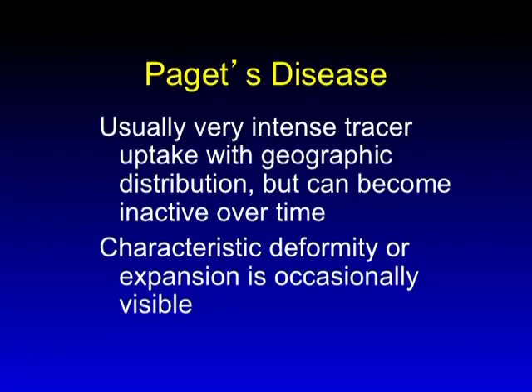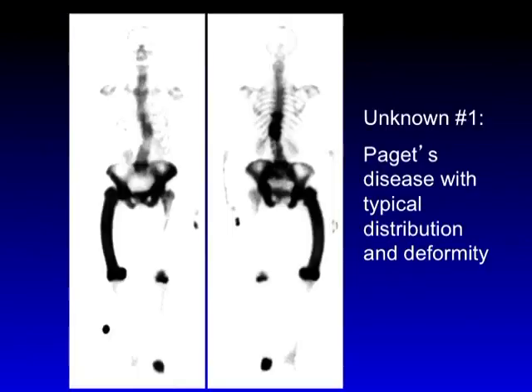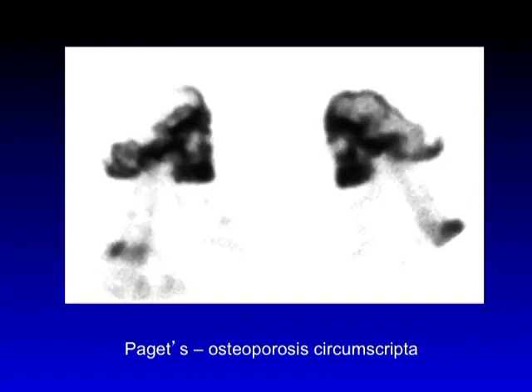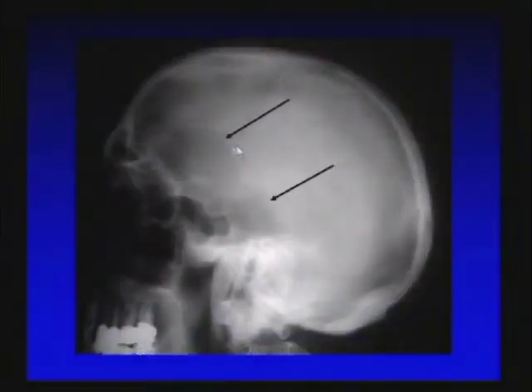Paget's disease usually presents as very intense uptake, starts at one end of the bone, moves contiguously with no skip lesions, with typical zones of involvement. You may have deformity. Here's our first unknown — this is Paget's disease. You've got a shepherd's crook deformity of the right femur, a blade of grass on the left, and characteristic zones of involvement. This is easy Paget's disease. Here we also have a patient with osteoporosis circumscripta — note the intense uptake in the facial bones, the anterior skull, and that sharp zone of transition between the abnormal and the normal. The abnormal here is lytic, a reminder that it doesn't matter whether it's lytic or blastic; what matters is that there's bone turnover.